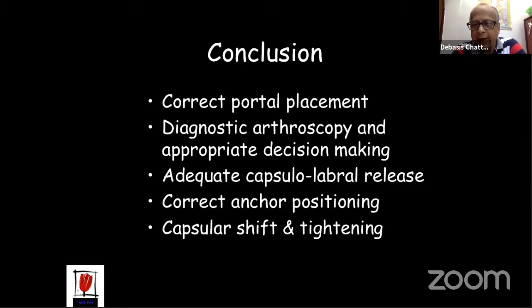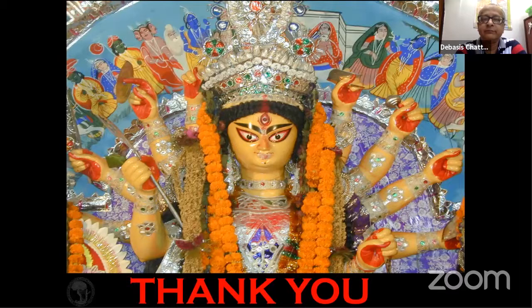And then correct anchor positioning, starting with the most important one right at the bottom. As they say, that is where you earn your money. And lastly, remember that the proximal capsular shift and tightening of the lax capsule, but not too tight, of course, is the key to success. Thank you, everybody. Thanks for listening.